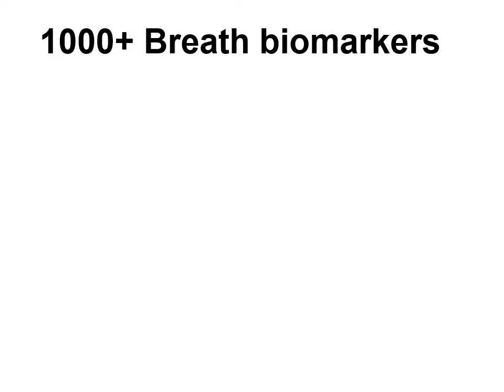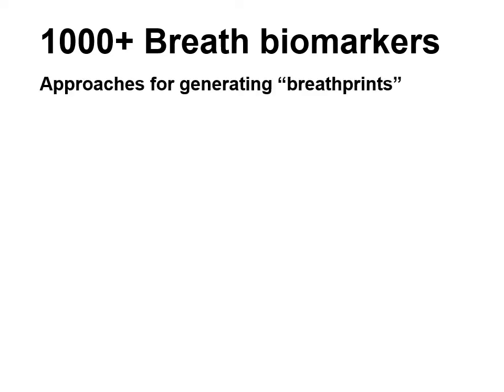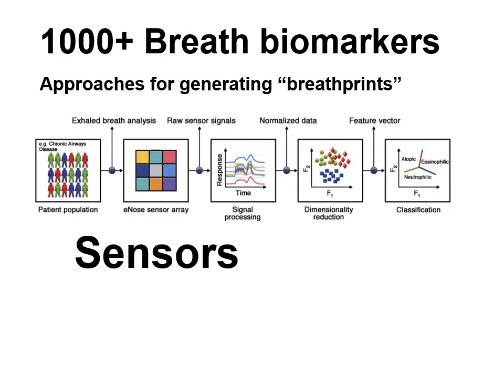The alternate approach is something that relies on sensors. So we're talking about electrochemical devices that can read the different gases in these breath biomarkers. Here is an example of the generalized approach. Patients will breathe into a device. An array of sensors will register that breath.